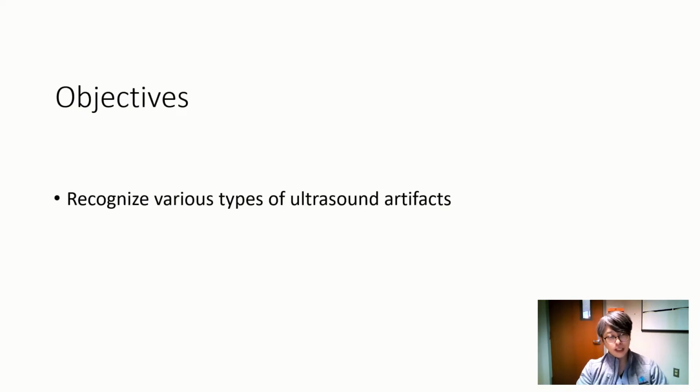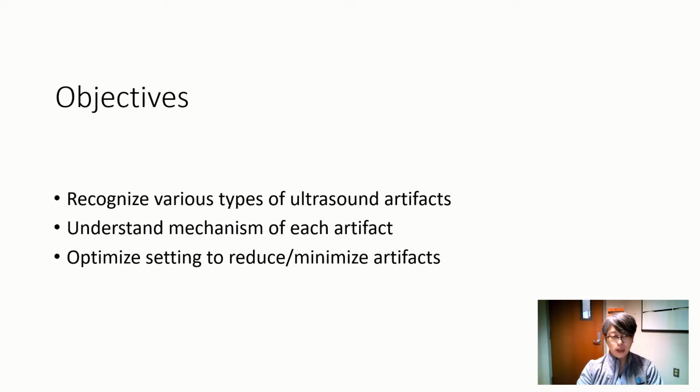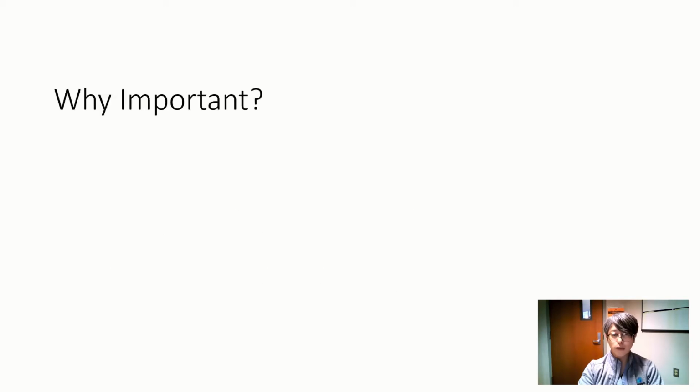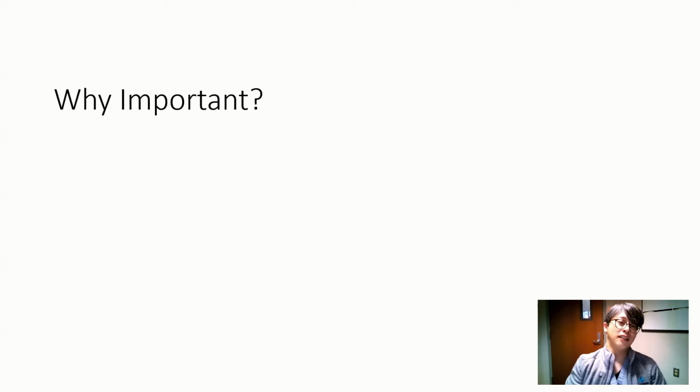And then for objectives: to recognize various types of ultrasound artifact, to understand the mechanism of each artifact, to optimize settings to reduce or minimize artifacts, and to apply that knowledge to aid diagnosis. Those are our objectives.